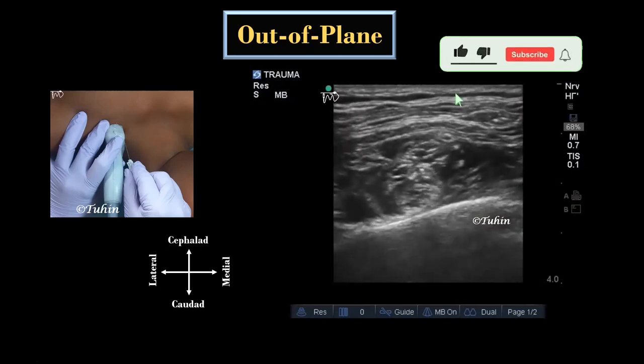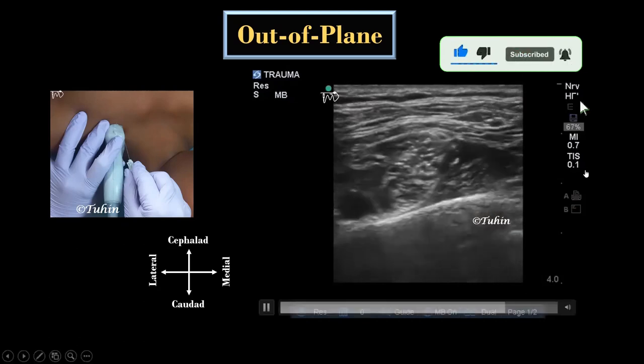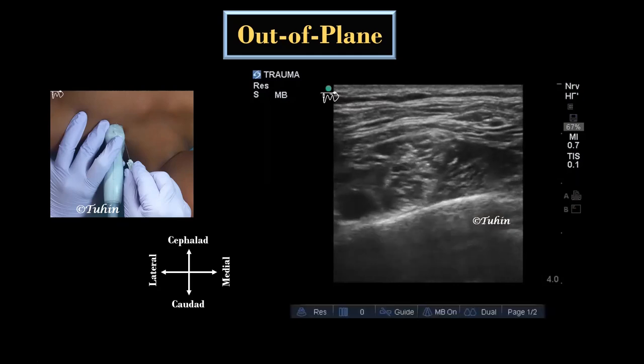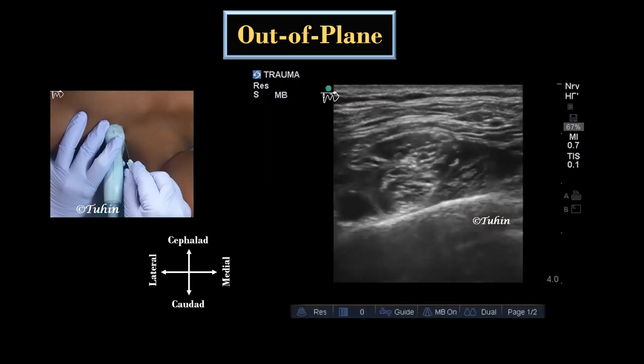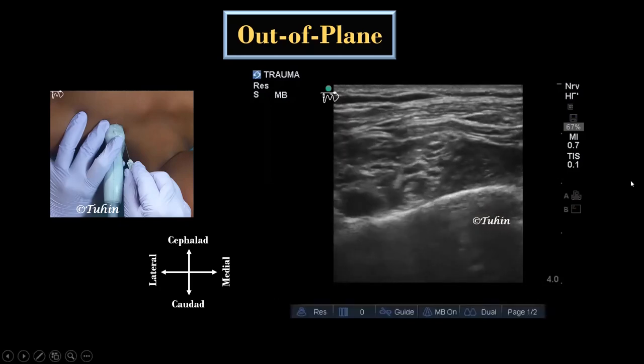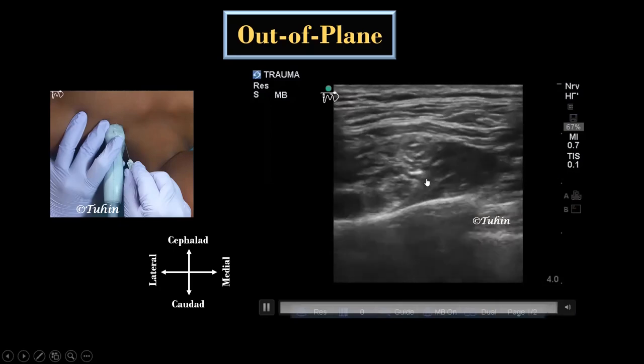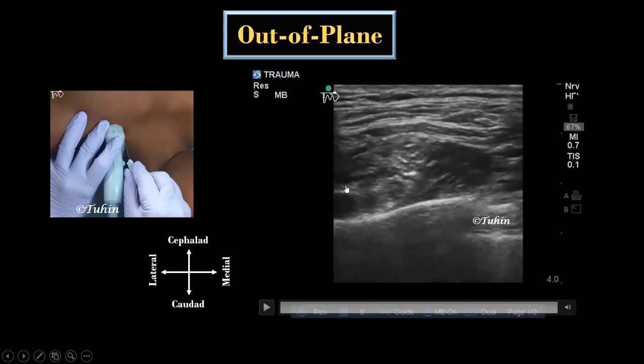Sub-fascial injection results in faster onset of surgical anesthesia and prolongs the duration of post-operative analgesia compared to extra-fascial injection. Here you can see the post-block scanning and spread of local anesthetic around the trunks and divisions.